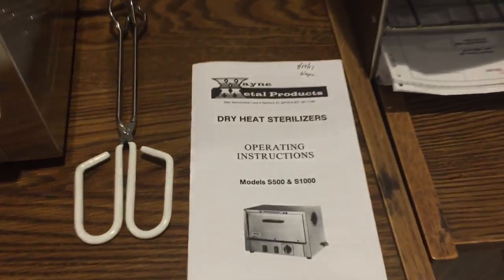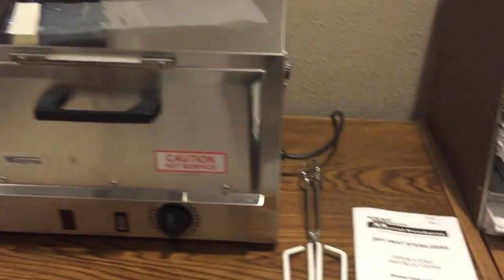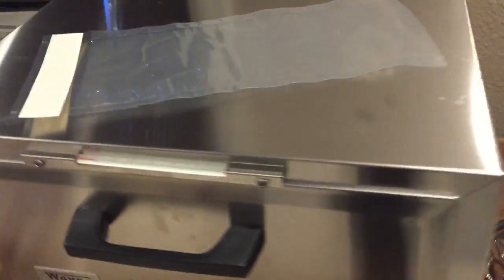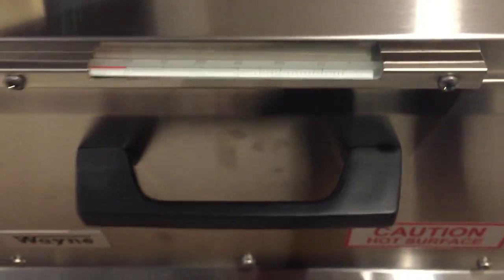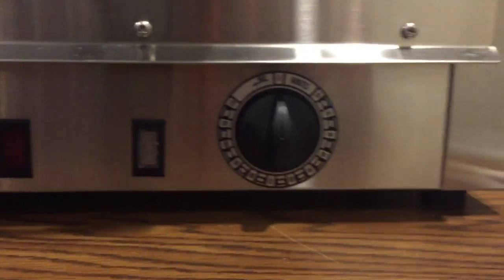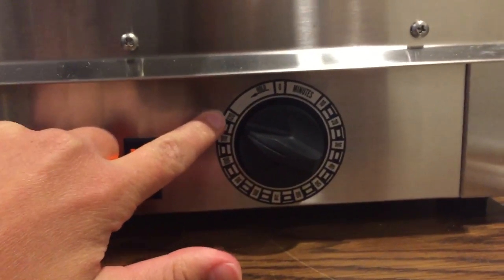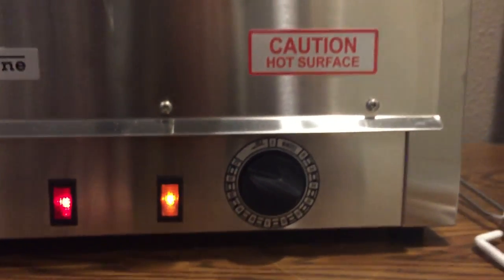This is the Wayne Dry Heat Sterilizer Model S500. Here is the thermostat thermometer that goes up to 350 degrees Fahrenheit, and here is our on button. It goes up to 120 minutes right here, and here is the hold in order for it to stay on the whole entire day.